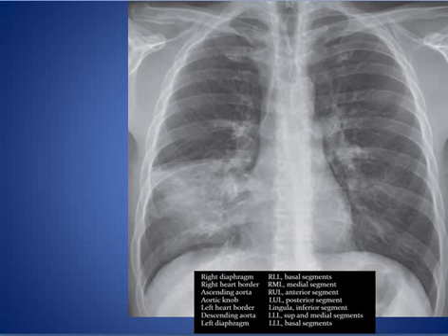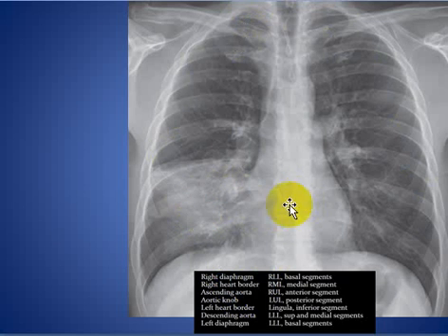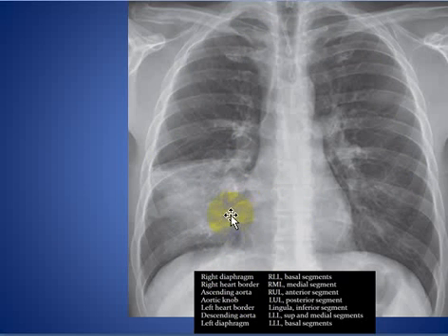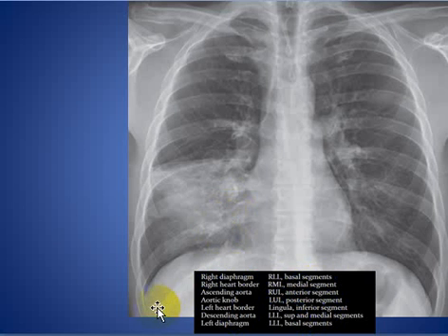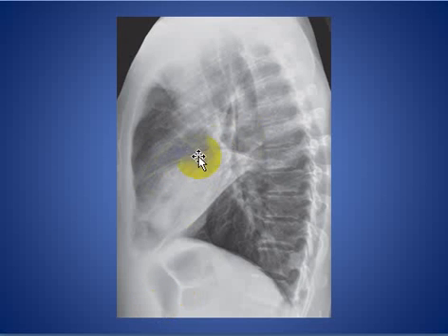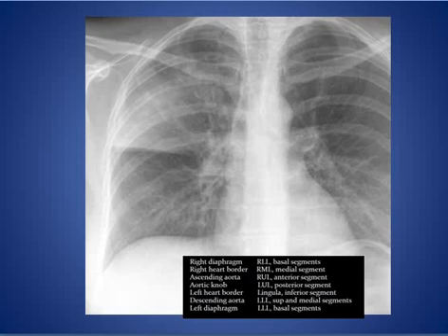Here is an example chest X-ray where we see an opacity with the same density as the heart, and it is obliterating the right cardiac border. According to the silhouette sign, obliteration of the right cardiac border means the lesion should be located anteriorly, in the middle lobe medial segment. On the lateral view of the same patient, you can see the minor fissure and the major fissure, confirming that the opacity is located in the middle lobe.